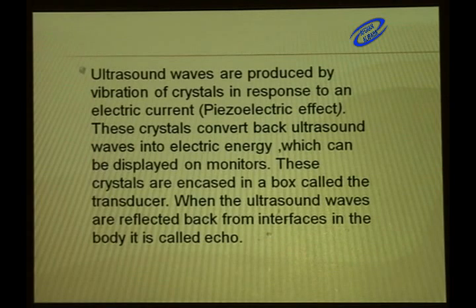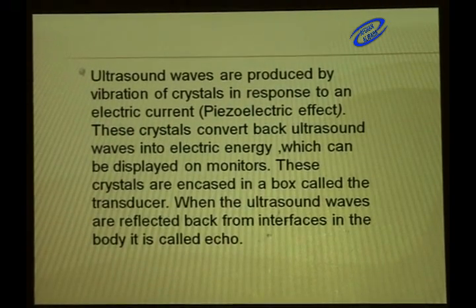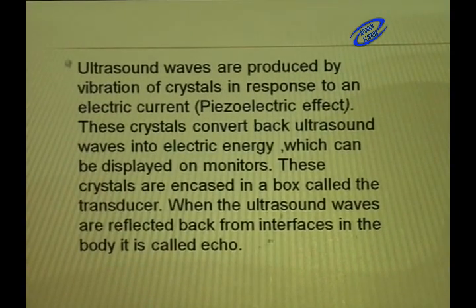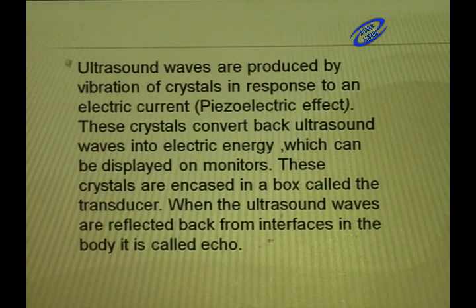Ultrasound waves are produced by vibration of crystals in response to an electrical current, and this is known as piezoelectric effect. Piezoelectric effect is the property of the materials which can convert one form of energy into another form of energy.